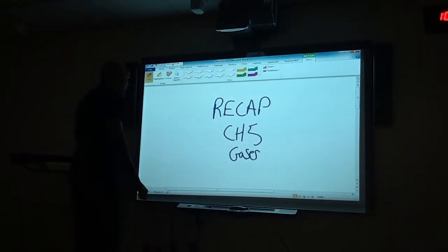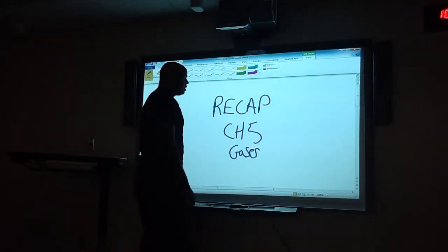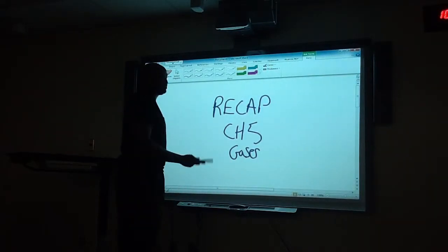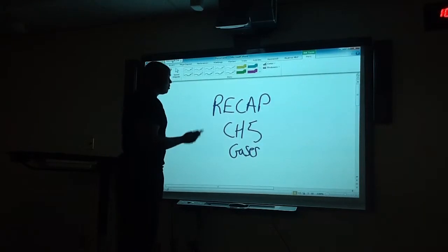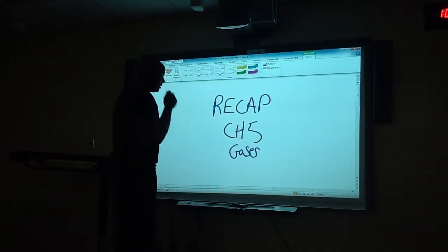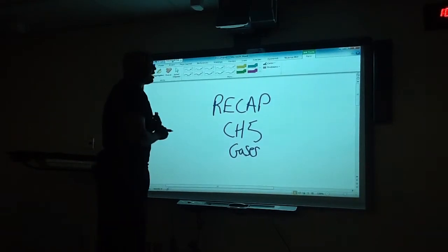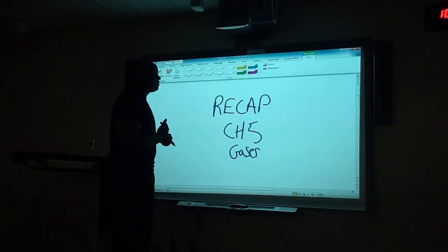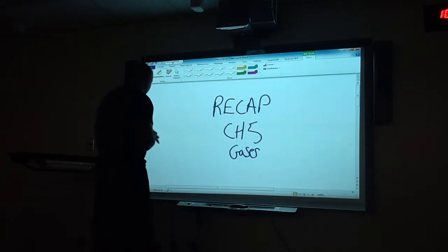We talked about the manometer, which is an apparatus that is used to allow us to gauge pressure. And it can be used different ways, whether that's atmospheric pressure, blood pressure, or other pressures. So we talked about the manometer, how it works in relation to reading the pressure of the blood when there's a certain pressure against the artery walls.